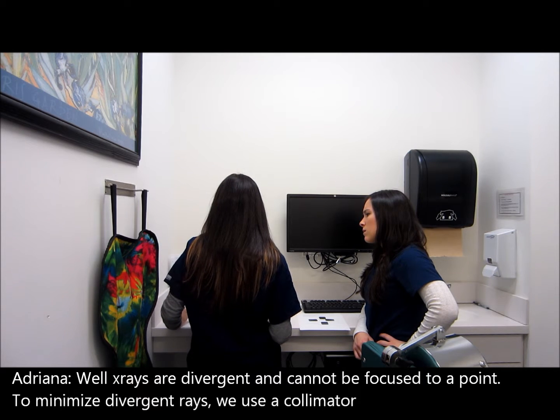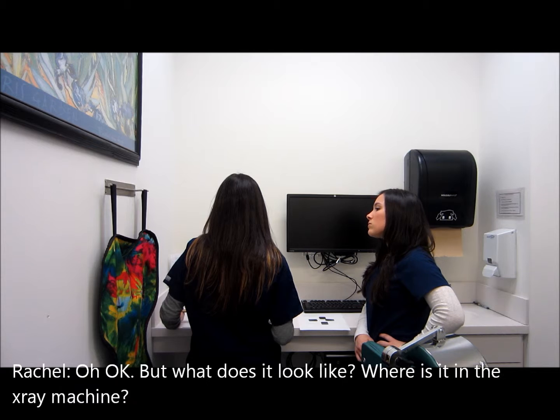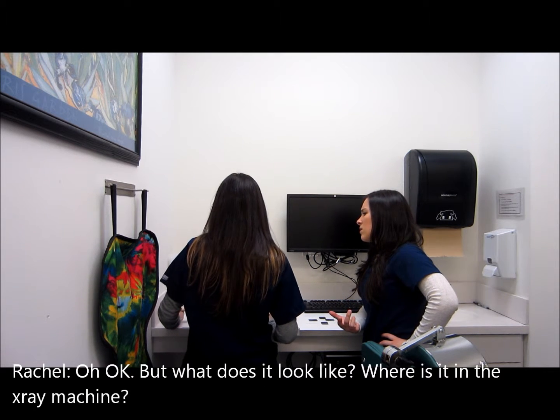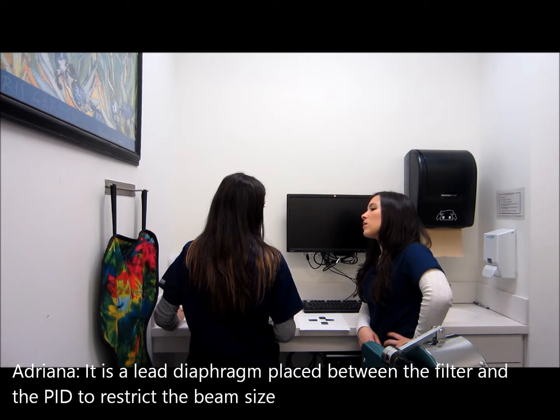Well, X-rays are divergent and cannot be focused to a point. To minimize the divergent rays, we use a collimator. Oh, okay. But what does it look like? Where is it in an X-ray machine? It's a lead diaphragm that is placed between the filter and the PID to restrict the beam size.